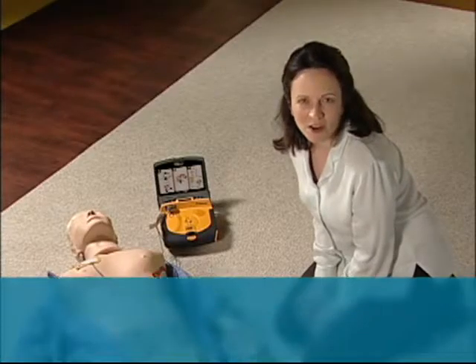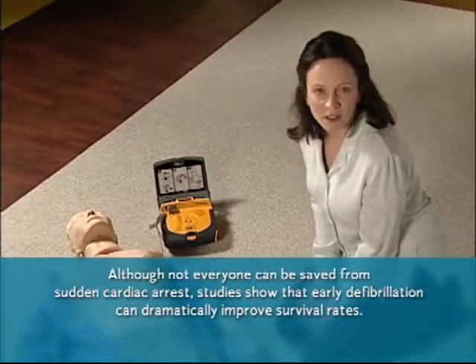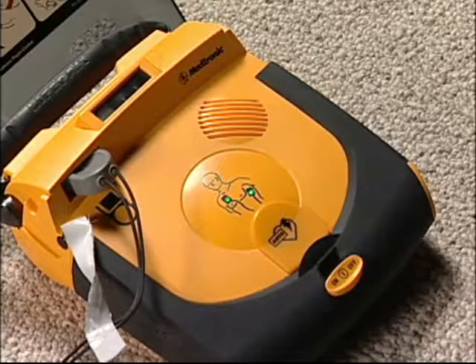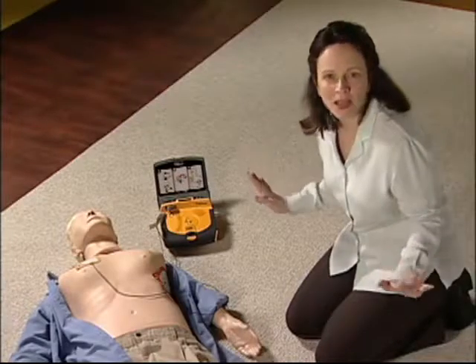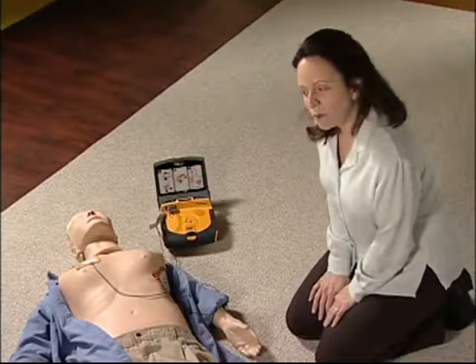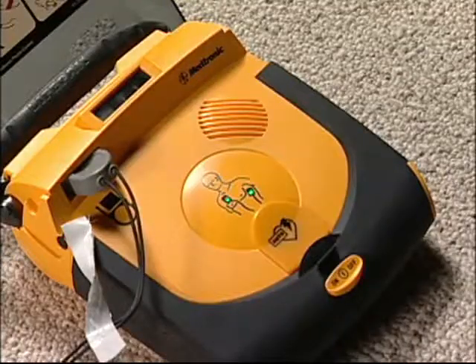While you're doing CPR, the Lifepak AED will interrupt you at intervals so it can check if another shock is necessary. Do not touch patient. Evaluating heart rhythm. Keep staying clear of the patient while the Lifepak AED is reevaluating. It might decide to shock again, or it might say, No shock advised. Provide chest compressions and rescue breaths.